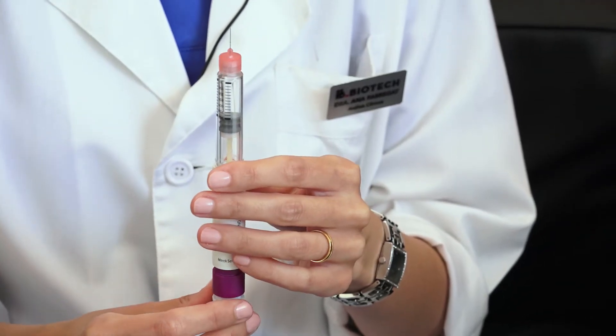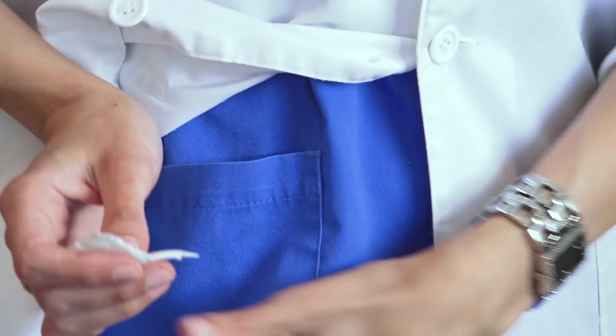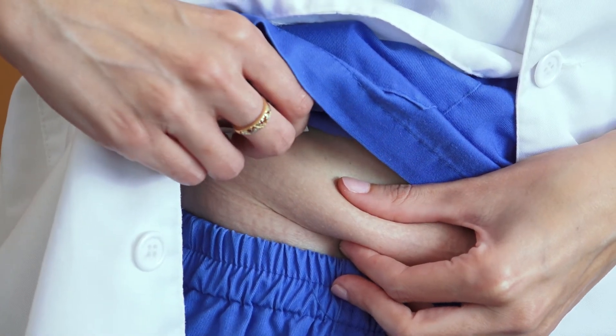Proceed with subcutaneous injection of the drug into the appropriate area of the abdomen. Before you give yourself the injection, disinfect that area of the abdomen using alcohol and then pinch it to make a fold.